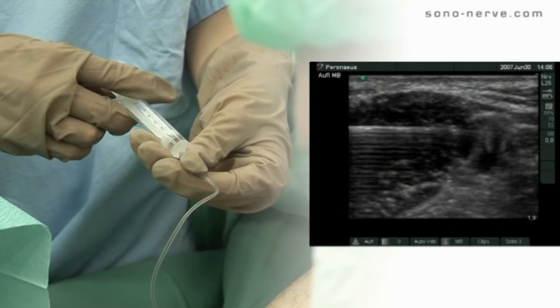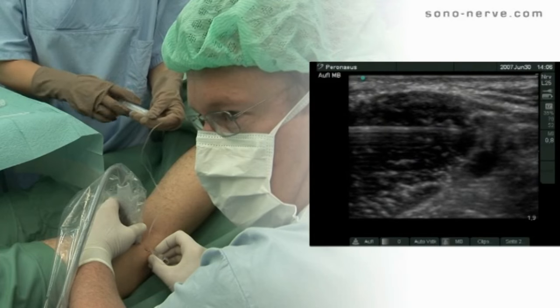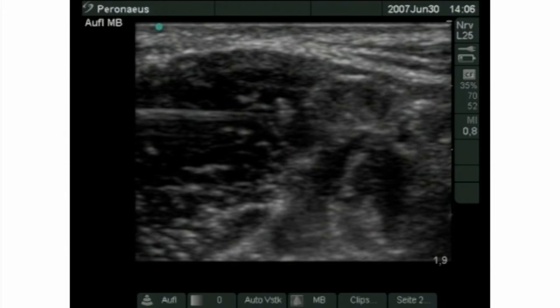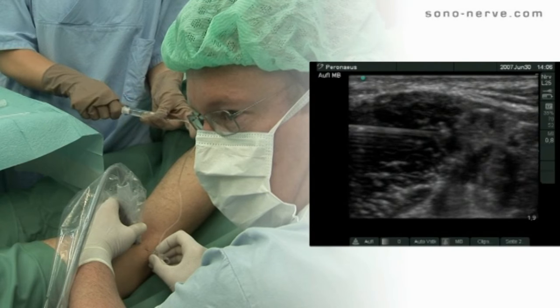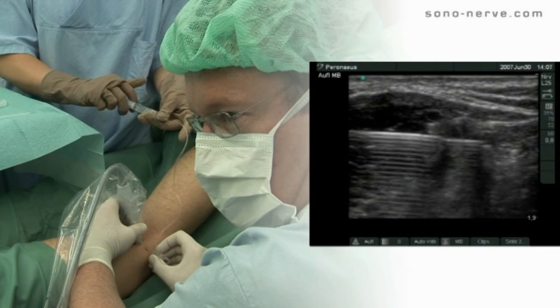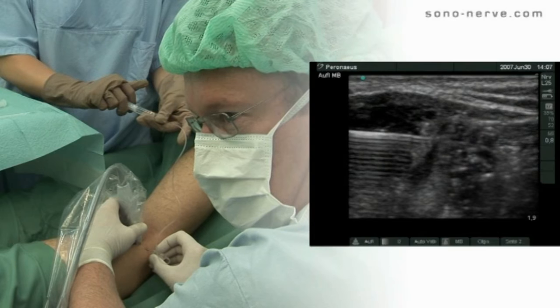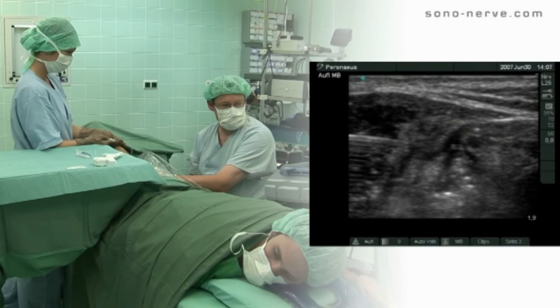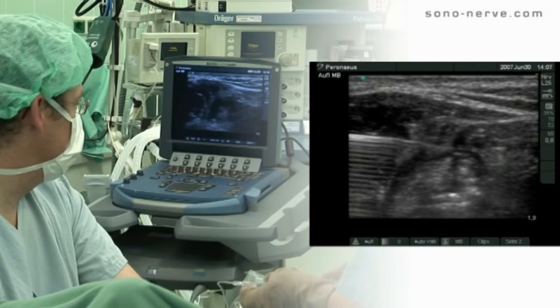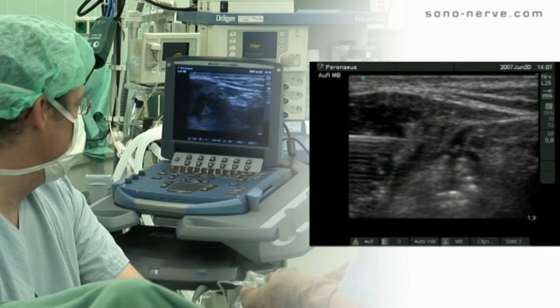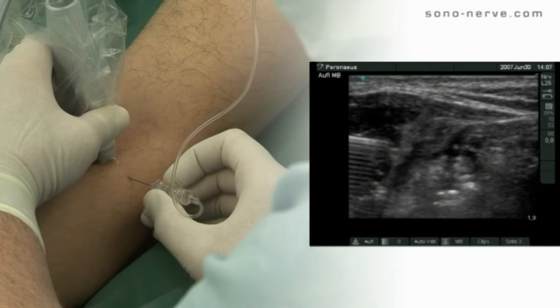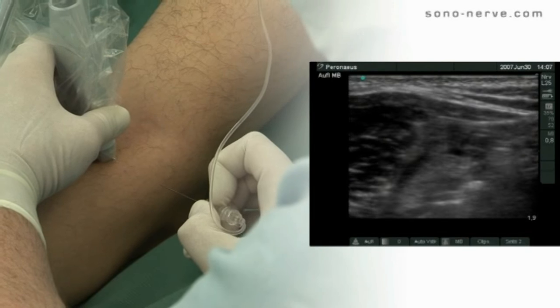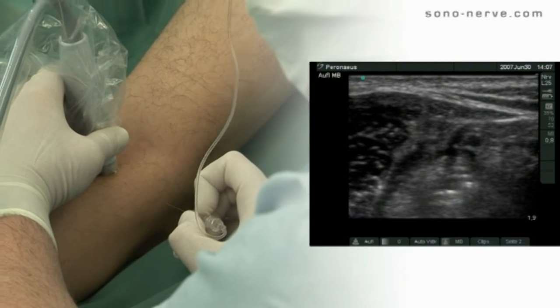After an injection lateral to the nerve, a further injection medial to the nerve is performed. Local anesthetic is injected until it is seen clearly to surround the nerve. The needle is then withdrawn and the operator checks that the local anesthetic surrounds the nerve.